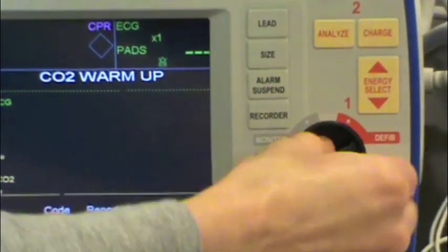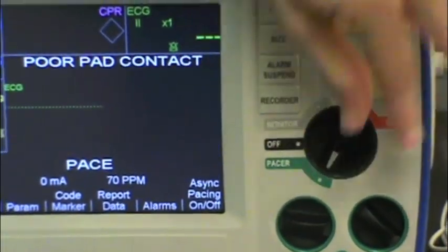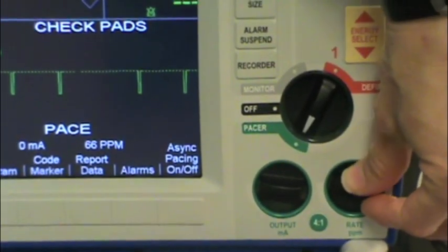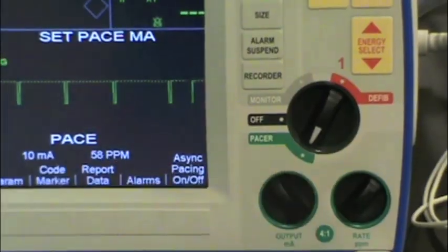The next function is the pacer. That's for somebody with a really low heart rate. You can adjust the rate and the milliamps output.